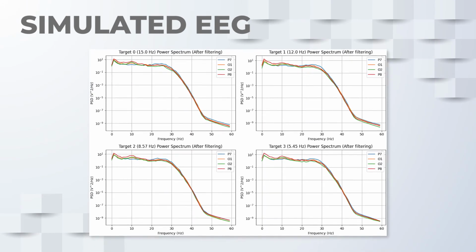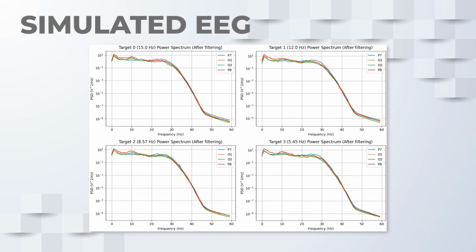We were unable to make accurate predictions with the EEG because there was not a high power at the desired target frequencies, as indicated by these power spectrum plots. Many times the power spectrum was the same across offline data for different targets.